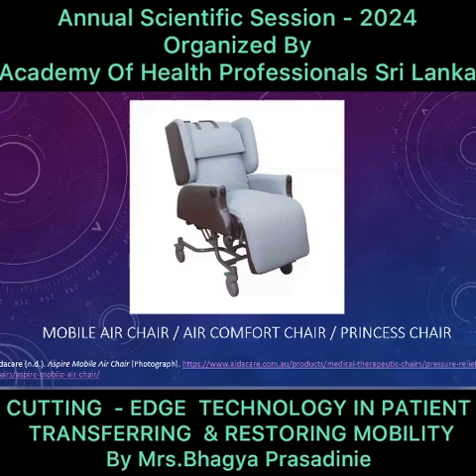So this is a mobile air chair, or in simple terms, we call it a princess chair. Of course, some of the private hospitals in Sri Lanka also have these. This is an air cushioned chair, which can be used if a resident is bedridden and cannot sit on a proper chair. Usually in the Sri Lankan context, all the bedridden patients are lying on the bed all the time. But this type of chair can be used to facilitate their mobility. So you can use this for indoor mobility.